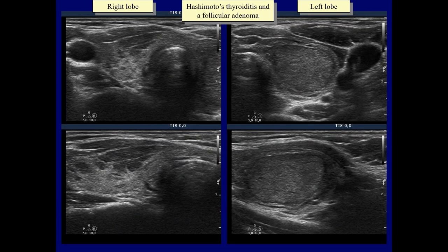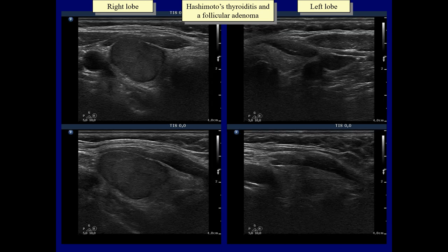The right lobe presents one of the typical sonographic presentations of Hashimoto's thyroiditis: the lobe contains multiple small hypoechoic areas not of regular geometrical shape. The left lobe contains a large nodule displaying a halo sign. In contrast with the right lobe, the left thyroid is not isoechoic but minimally hypoechoic. The nodule in the right thyroid presents a halo sign all along the borders, which makes it very likely that the lesion is a follicular tumor.